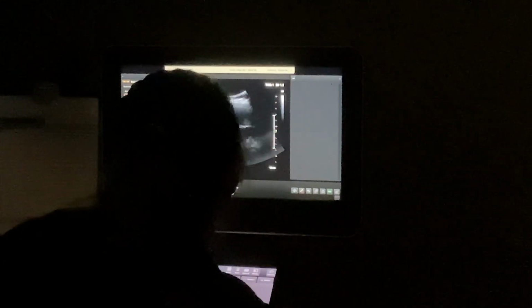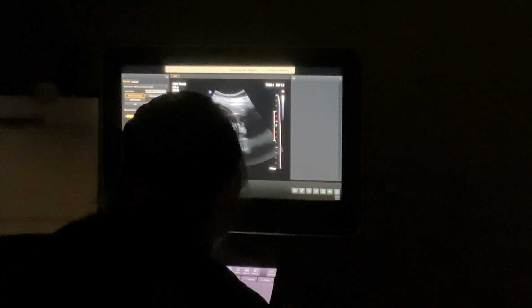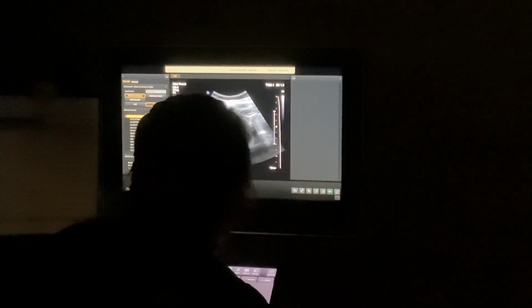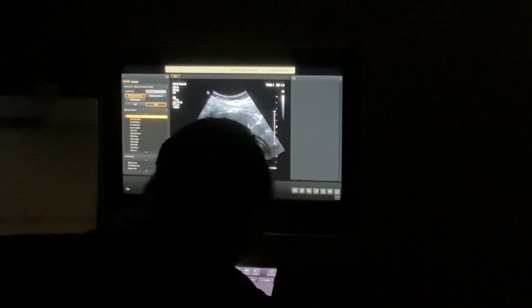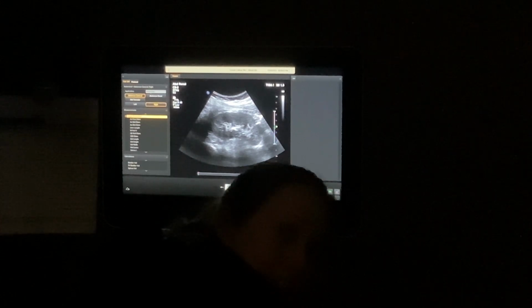So I'm going to start a little higher and further back on her. Hey, wouldn't you know it, a kidney? I do know what I'm talking about sometimes. All right, deep breath. So on her, I am finding to get a good kidney picture on her, decent, look at how far back I am. It's really far back, right?